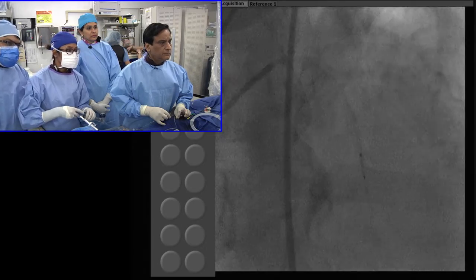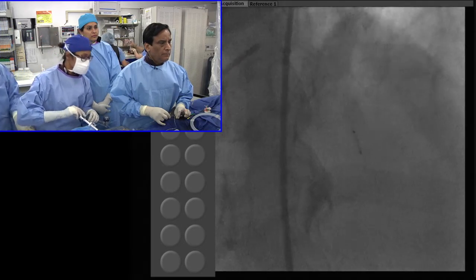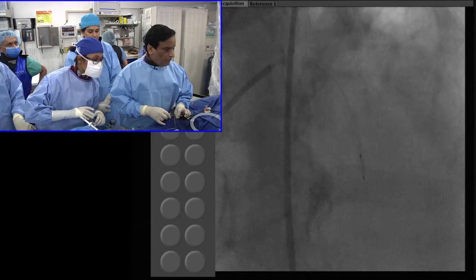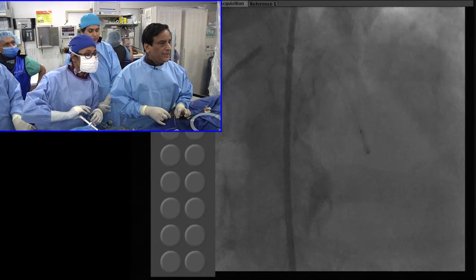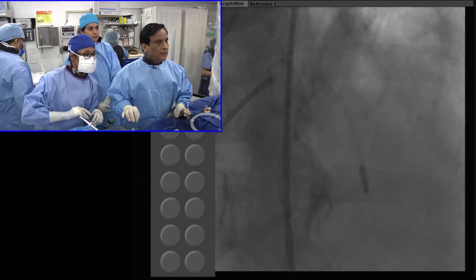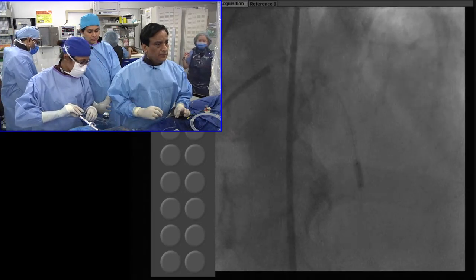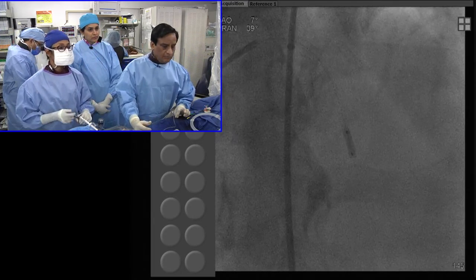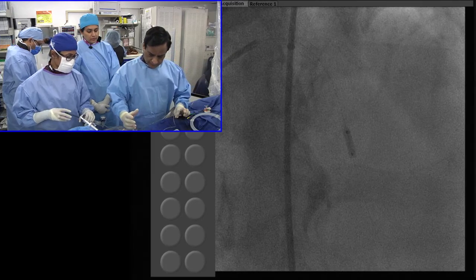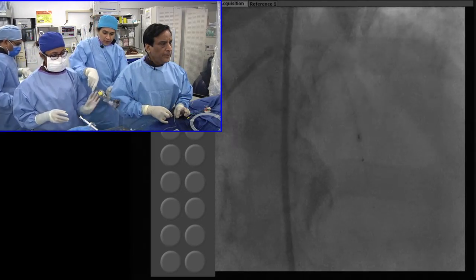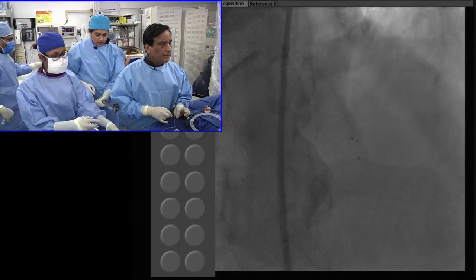That should take care of the distal lesion. You actually predicted that earlier. It didn't have a good feel to it and it's such a large vessel. Let me pull back one millimeter and then we'll take it.